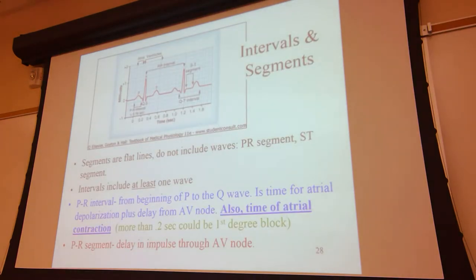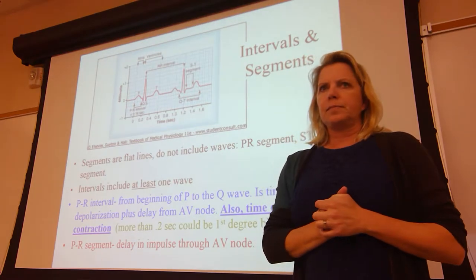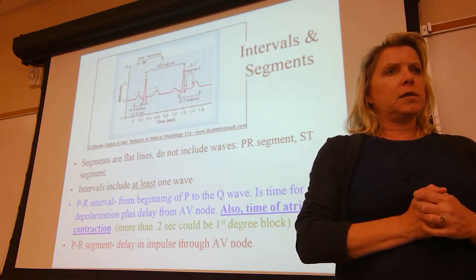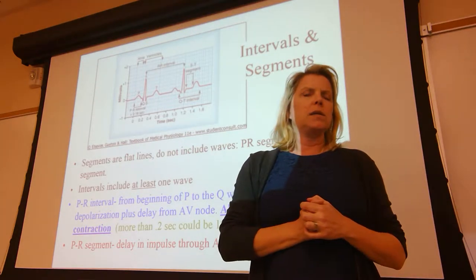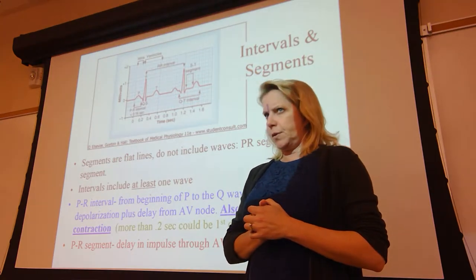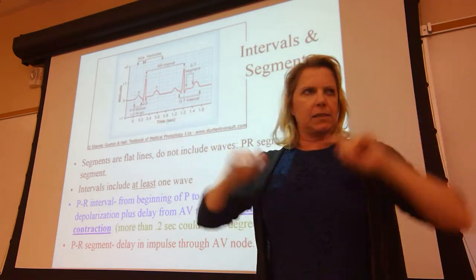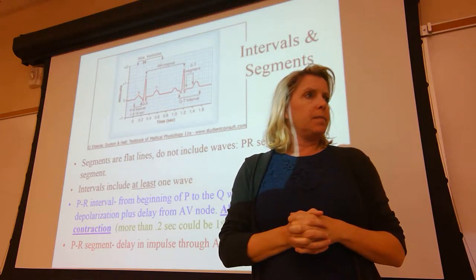Continuing on with your matching segment, segments are flat lines. Here are the segments you are responsible for: the PR segment, the ST segment, and the TP segment, three of them. Your responsibility is to show me where they begin and where they end, and how to measure them in distance. We're going to work on that in just a moment when I'm done talking to you.